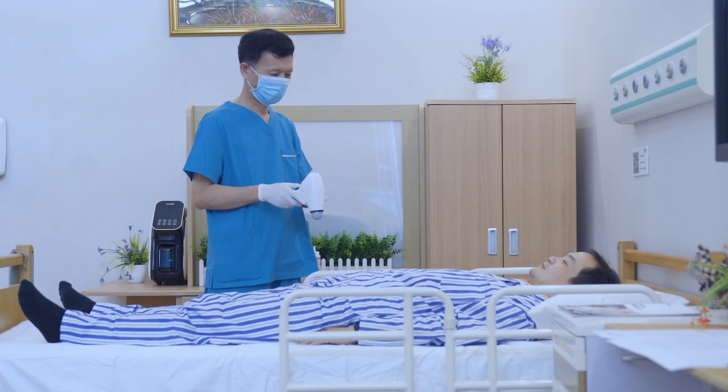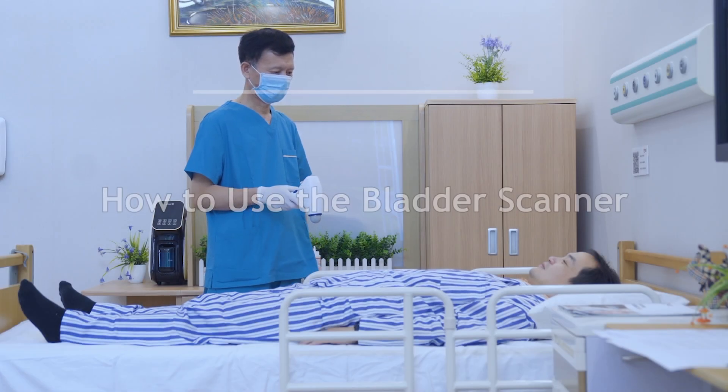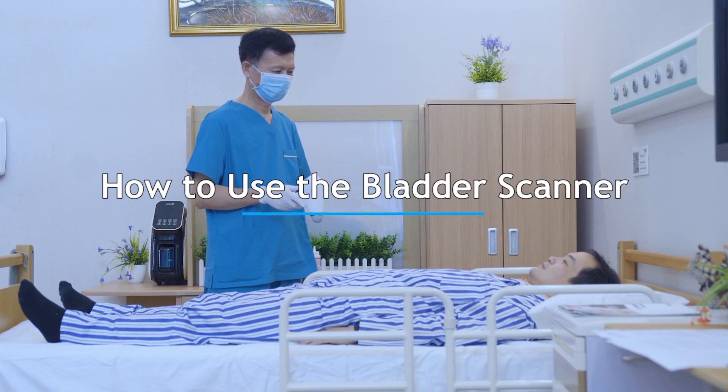After you get familiar with the device, we are ready to show you how to use it to measure the bladder volume.